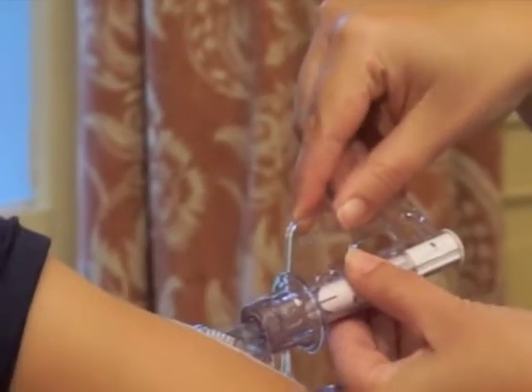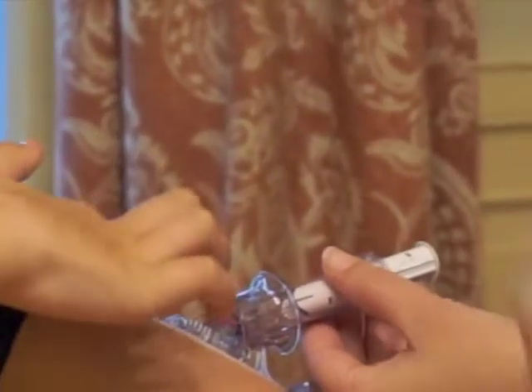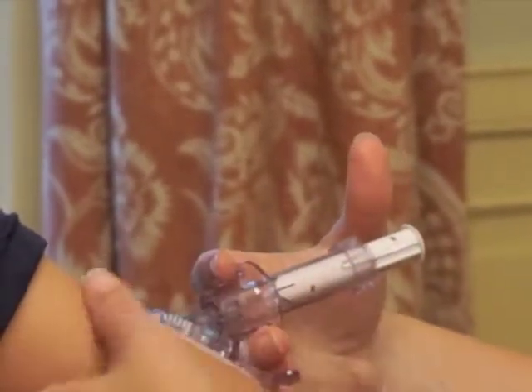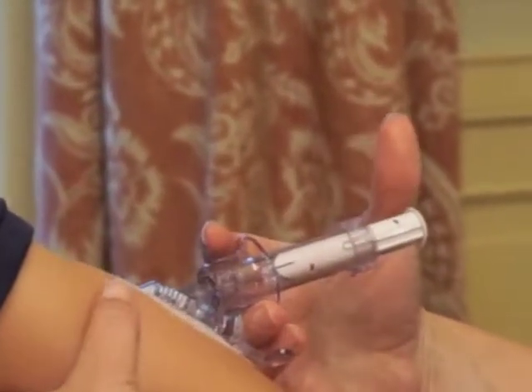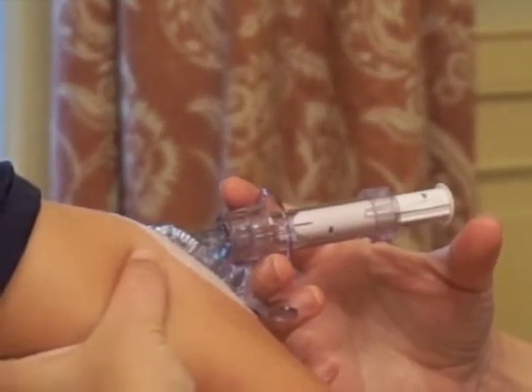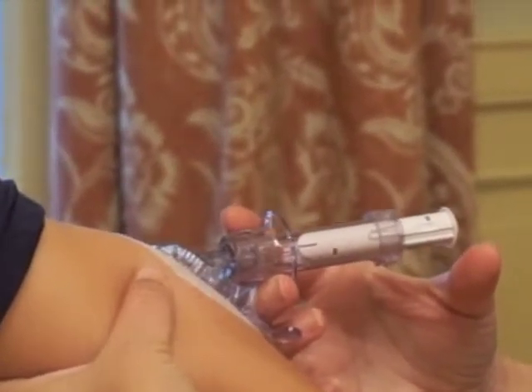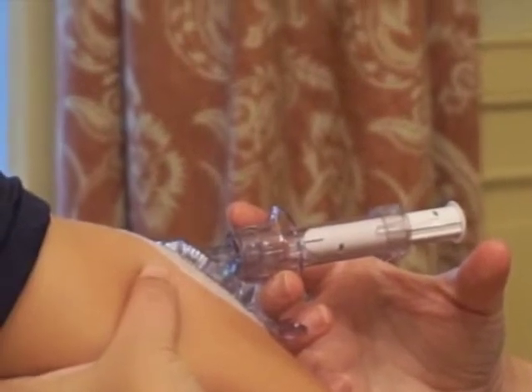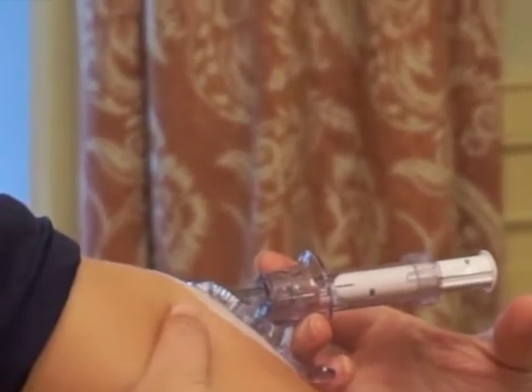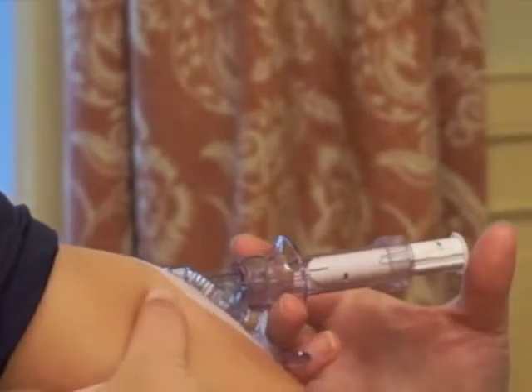Here I go taking the key out — you just slide it right out on the top. Then at the same time that you push down on the white part, you pull up on the plunger. Also make sure you pinch the skin — we learned that the hard way too — or it will hurt your child very, very bad. It helps to pinch the skin and get a good layer of fat.